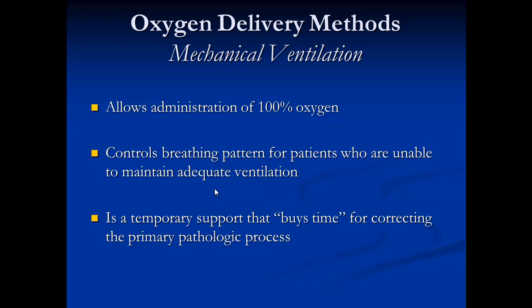Mechanical ventilation is basically provided via an endotracheal tube. It is a common support used for critically ill patients, and it's the definitive intervention to ensure adequate oxygenation and ventilation. It does allow the administration of 100% oxygenation.